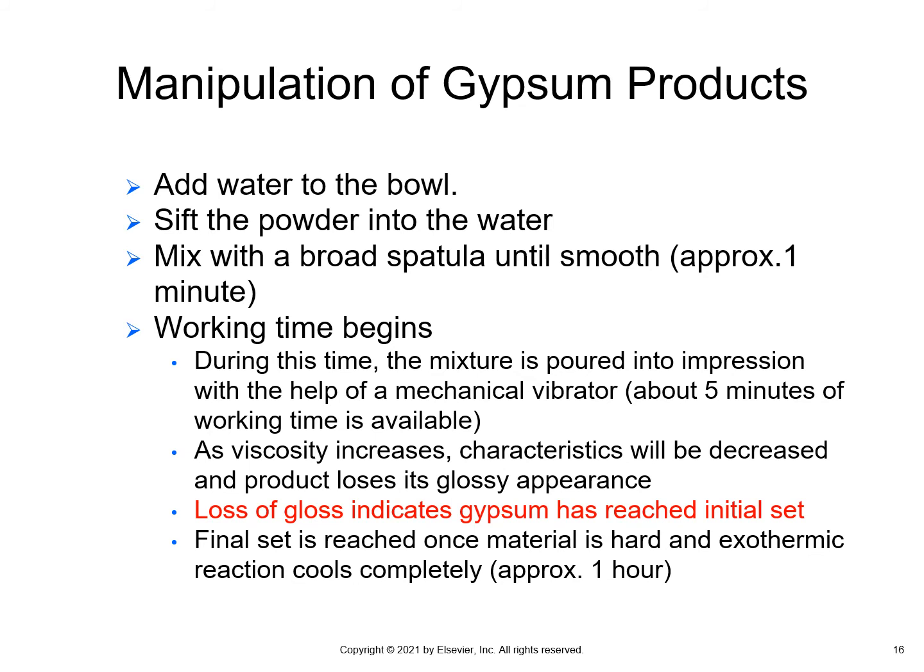Its final set is not reached until the material is hard and cured completely, and we no longer feel that warmth. That exothermic reaction has stopped and the material has cooled completely, and typically this takes around about an hour for it to run its course.